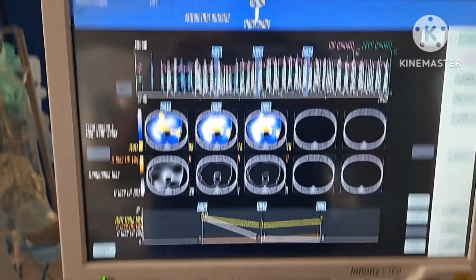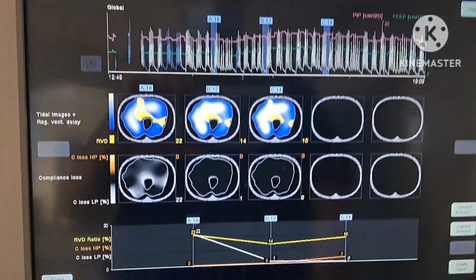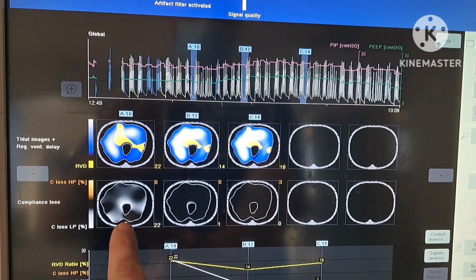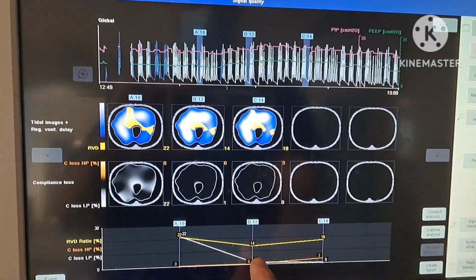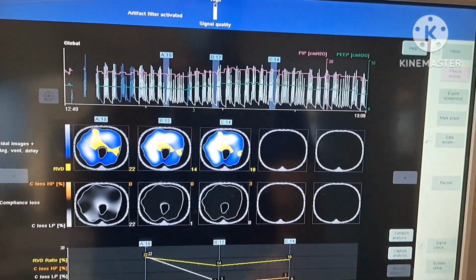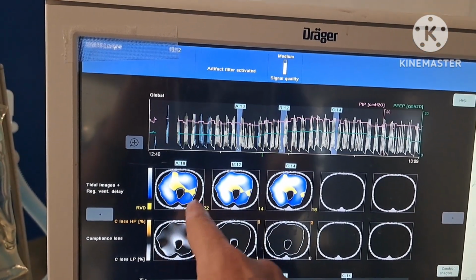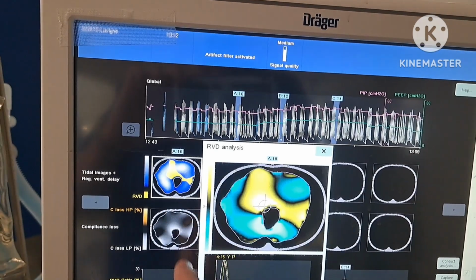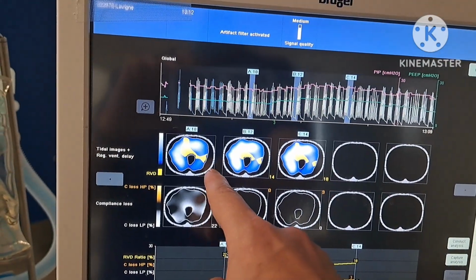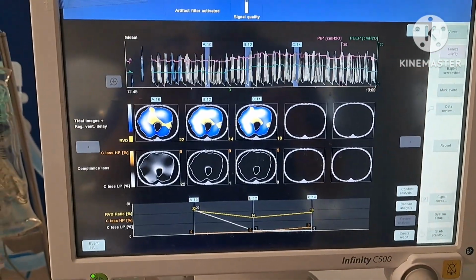All right, and for closing this case, last but not least, the final 10, 12, 14 titration: loss of compliance at a PEEP of 10, perfect pretty much with 12, 14, minimal overdistension. Since I'm seeing white, and he did previously close here, and there's less cyclical opening and closing as well, 12 versus 14. So the optimal PEEP is, in my opinion, we're going to do 12.